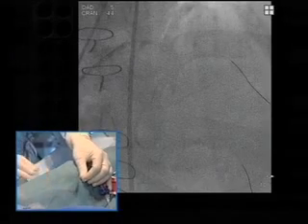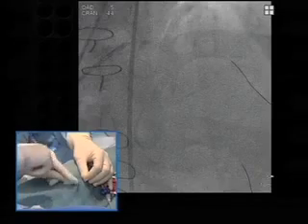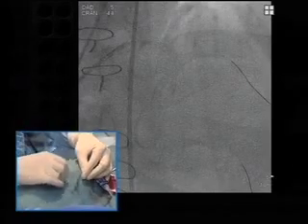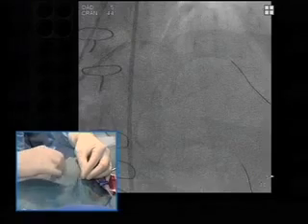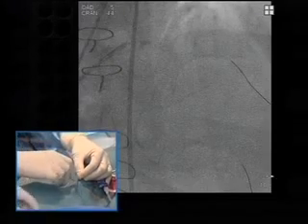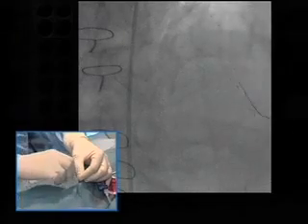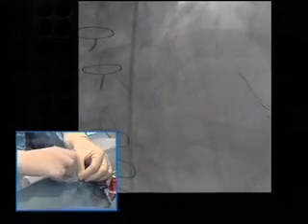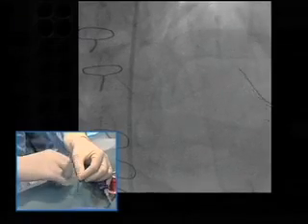I would favor reverse mini T stenting or mini crush in this type of lesion because the side branch is relatively small. Yeah, the lesion is really very short, and maybe it's just due to the plaque in the main branch.